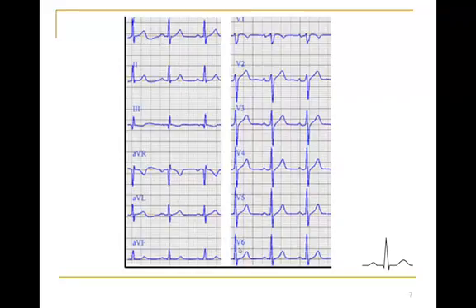Another thing, while I'm here on this picture: with left ventricular hypertrophy, I gave you the criteria for your limb leads, and that's what I'm going to give you in case studies on your exams or even in assignments. But voltage is usually higher in your chest leads because they're right smack dab over the parts of the heart.